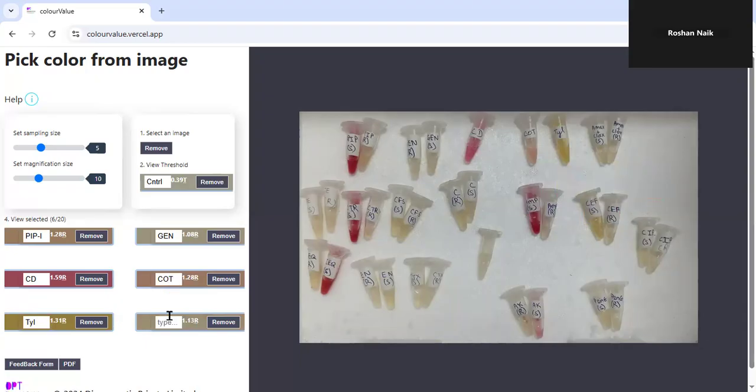Whenever the color of the susceptible tube looks higher, then you compare it with the resistant tube. If the color is lower than the susceptible, one tube analysis is enough. Unlike here in piperacillin, because the color was higher in the susceptible but lower in the resistant. That's why I analyze both to understand if it is resistant or intermediate. So this was amox plus clox.